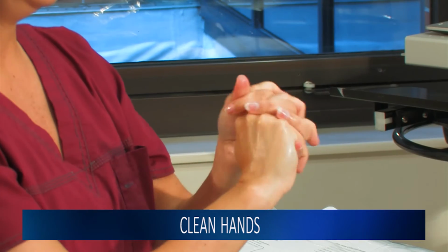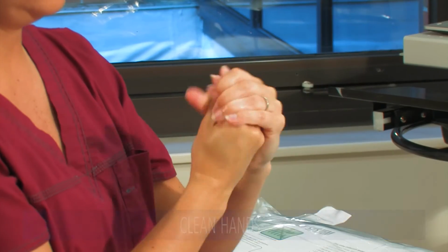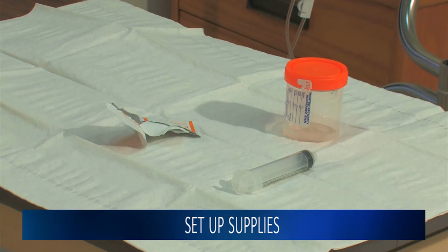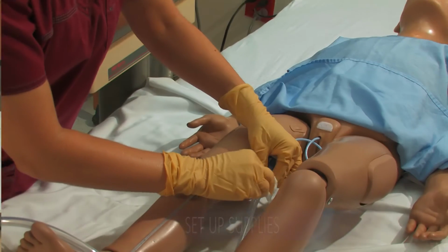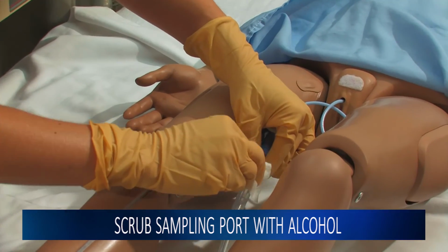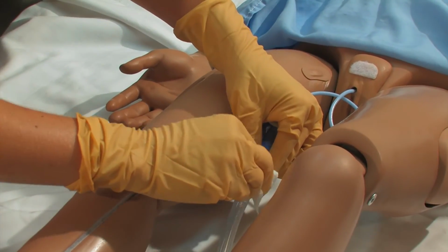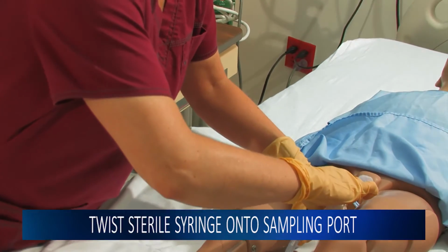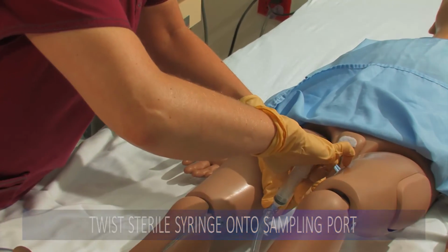To obtain the samples, first clean your hands. Next, set up the sterile field with supplies using the sterile technique. Then, scrub the sampling port with alcohol for 15 seconds and let dry for 15 seconds. Twist the sterile syringe onto the sampling port without contaminating the tip of the syringe.